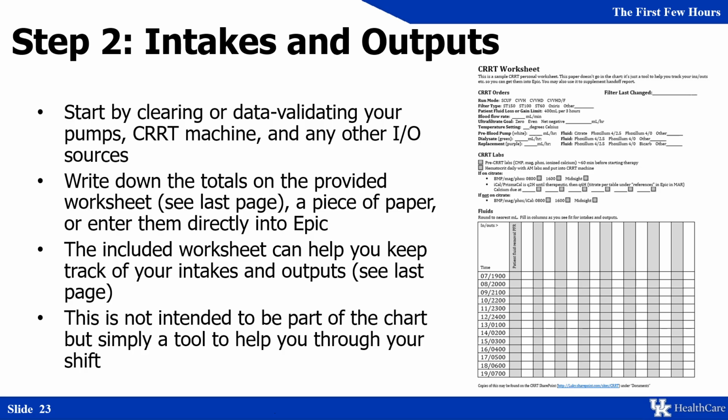If you need to clear things physically, we have a worksheet that you can use to keep your brain together. Since we've gone live with the Alaris Epic integration, I have noticed quite a few people still using that. I don't know if that's out of habit or if it's still very helpful, but this is a tool that you can use. Obviously, it's not part of the chart, and you just shred it at the end of your shift.